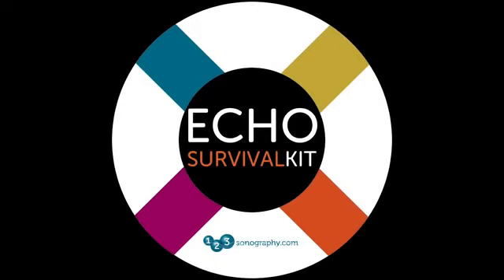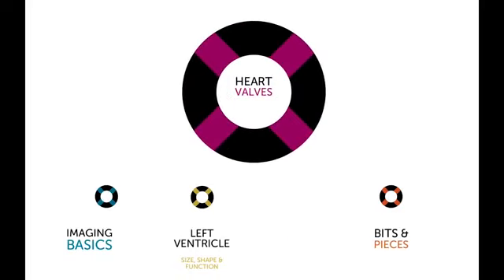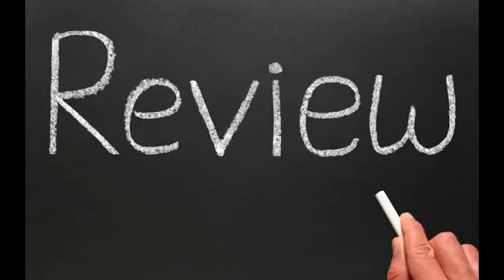Welcome back to the Echo Survival Kit. This is part 3, in which we will be dealing with the heart valves. Before I get started with the valves, a short review of what we did last time.